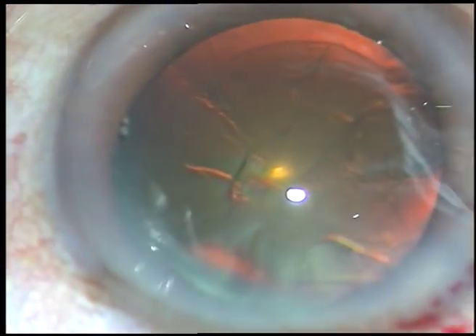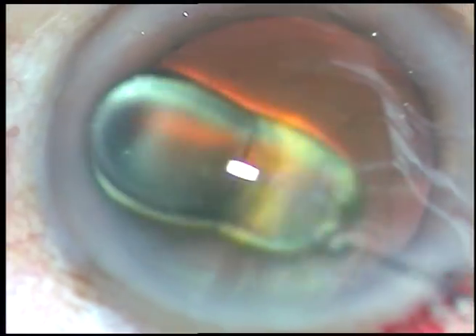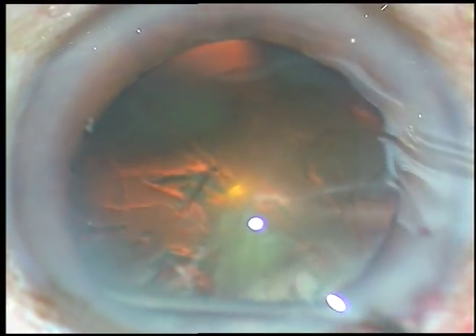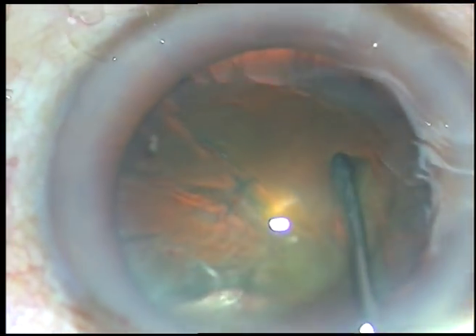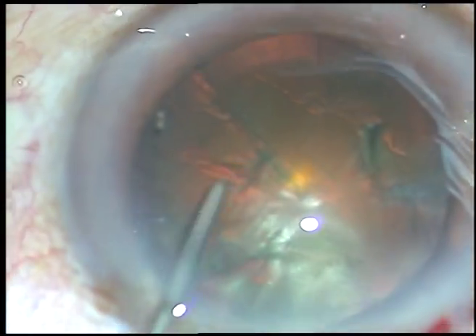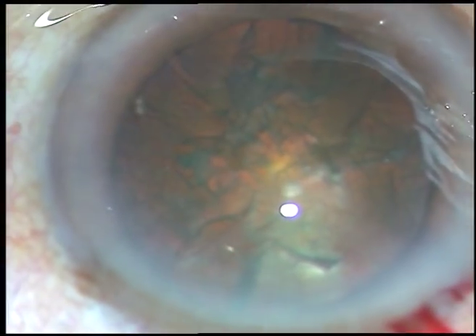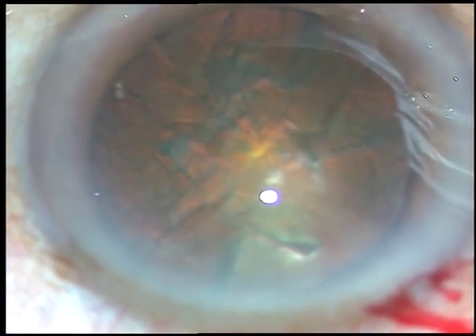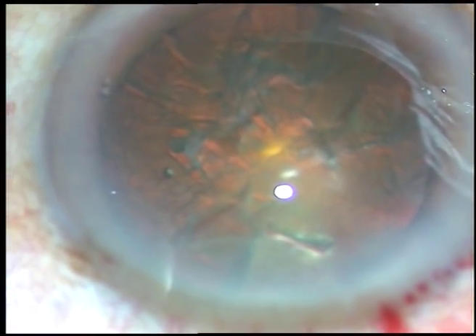And now do hydrodissection. Take BSS and a 27-gauge cannula. Inject small amounts of BSS just underneath the anterior capsular rim at multiple points. Tap the nucleus, rotate the nucleus, and then inject some more viscoelastic substance.